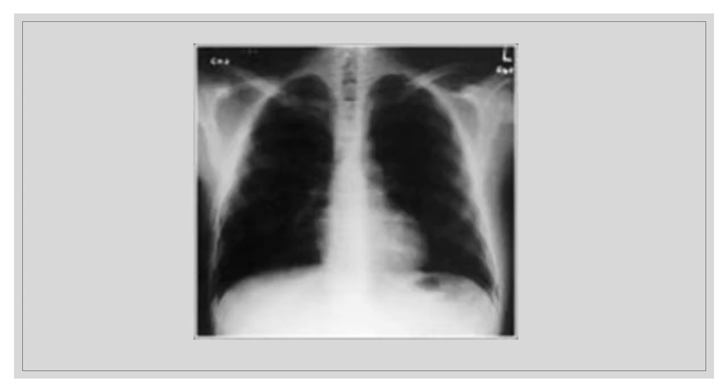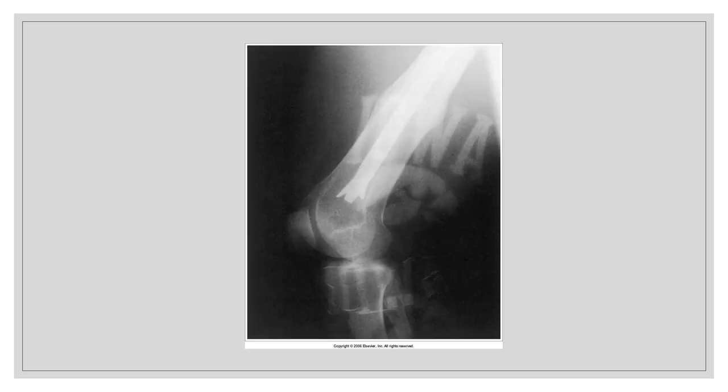What type of artifact? Equipment. A double exposure again. However, I feel like this is more of a blurring than it is a double exposure, but it says it's a double exposure.